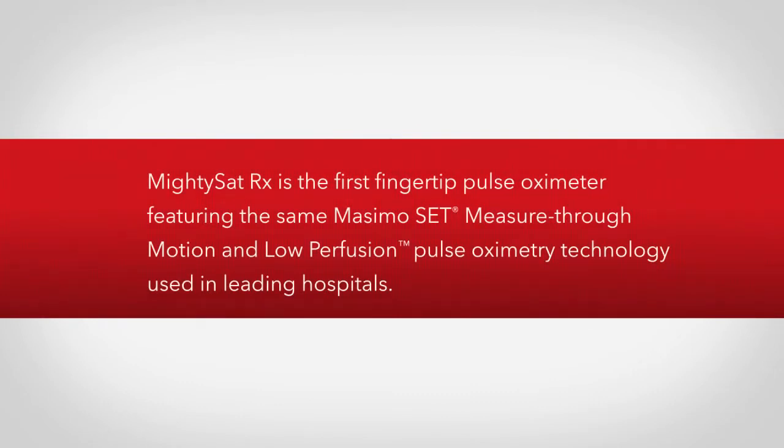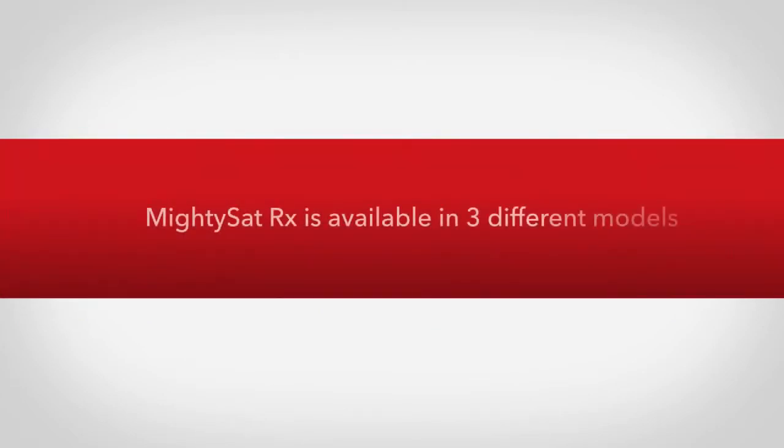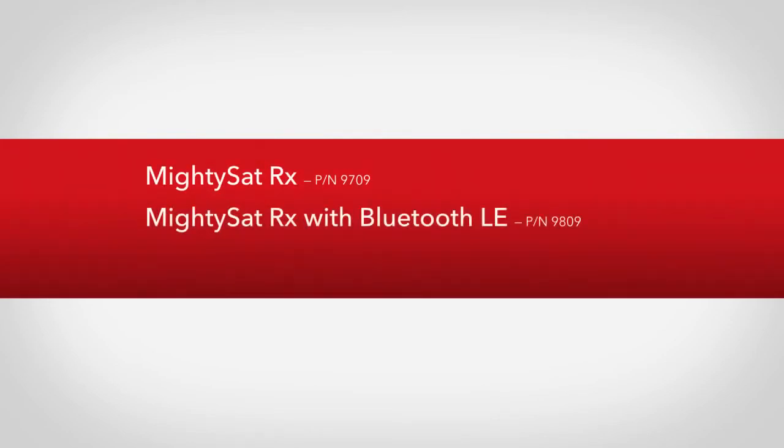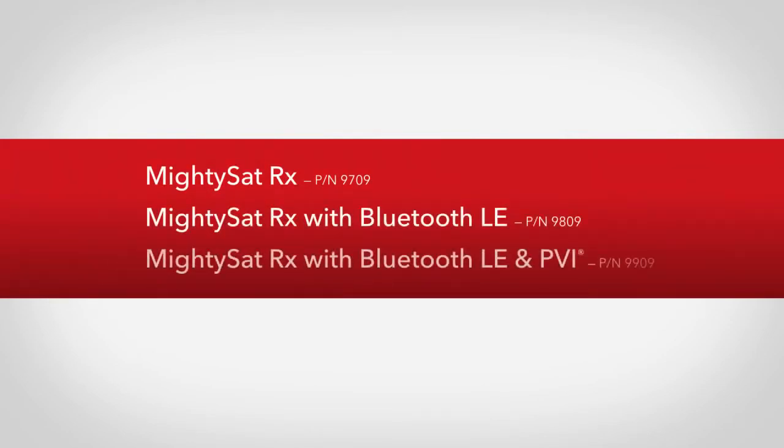MightySatRx is the first fingertip pulse oximeter featuring the same Masimo SET measure-through-motion and low-perfusion pulse oximetry technology used in leading hospitals. MightySatRx is available in three different models: MightySatRx, MightySatRx with Bluetooth LE, and MightySatRx with Bluetooth LE and PVI.